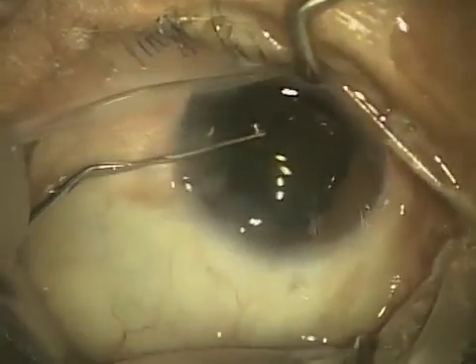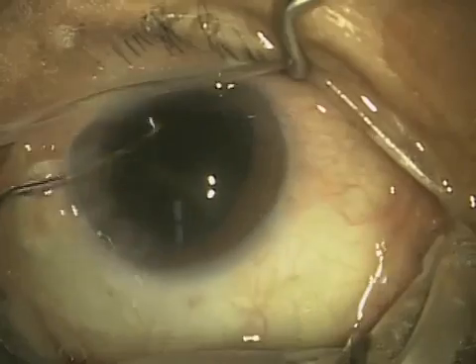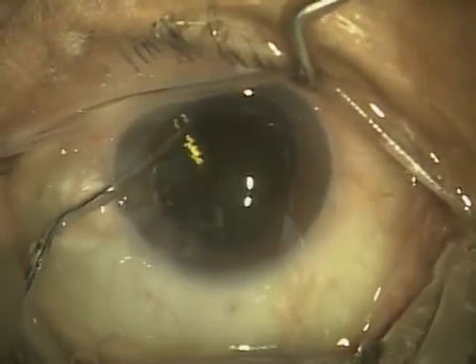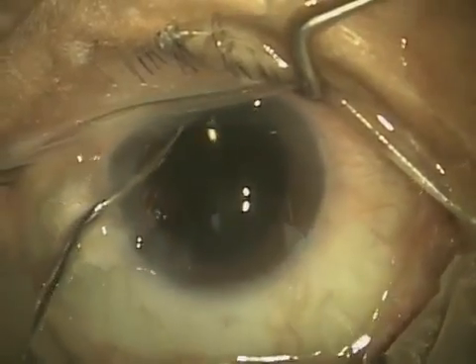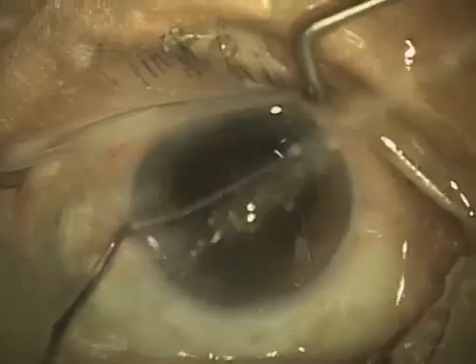Incision sizes range from 1.8 all the way up to 3.2, but we really don't see much larger than 3.2 now. Years ago, incisions were as large as 11 to 13 millimeters. That may not seem like a lot, but when you're talking about the eye, it's pretty big.